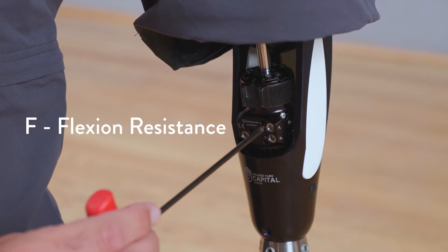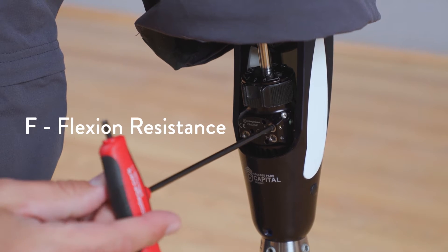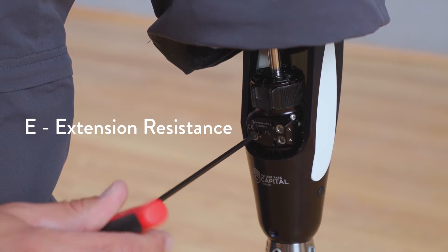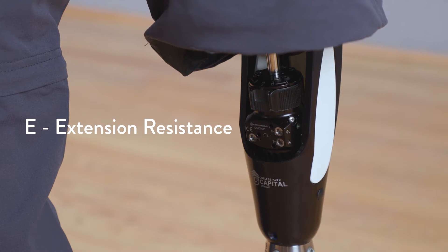F is for flexion resistance — this adjusts the hydraulic resistance to flexion in swing phase of gait. This is most effective to optimize heel rise and swing. E is for extension resistance — this adjusts the hydraulic resistance to extension in swing phase to optimize terminal swing characteristics.